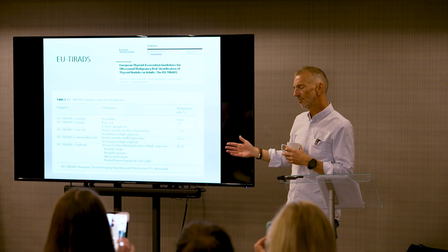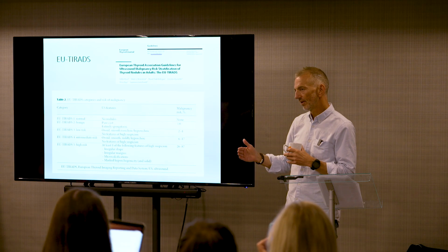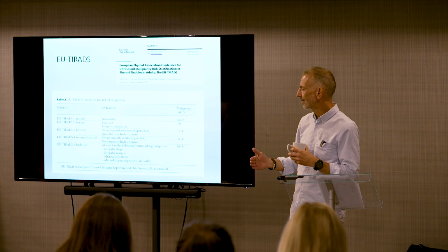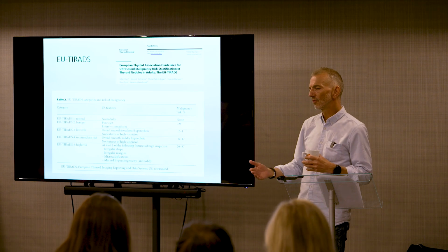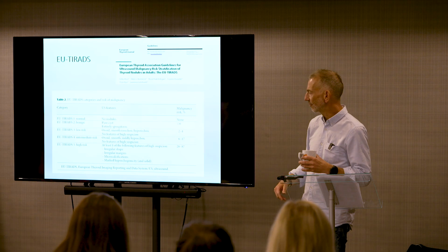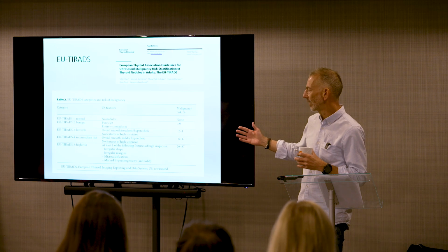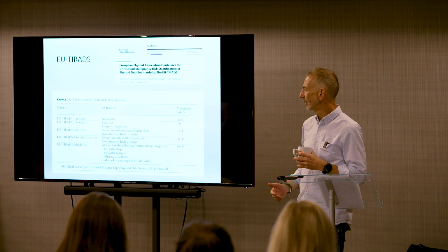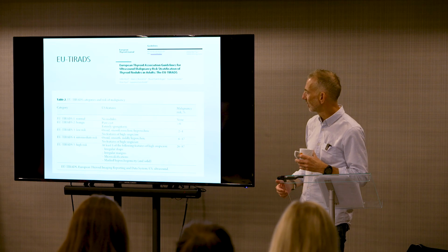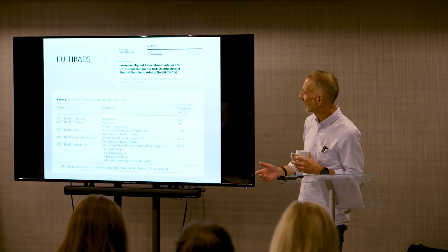It's much more uniform and less subjective and open to interpretation. And it's more in keeping with what the rest of the world use, although there's the American version of TIRADS or the Korean version of TIRADS or whatever. And I'm sure this is the way things are going to go over the next 5 or 10 years. I think this will become the main reporting mechanism, reporting ultrasound classification. Next slide, thanks.